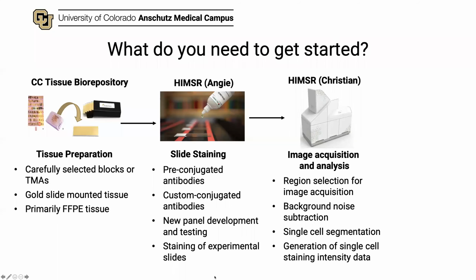Once the slides are stained and dried, they go to Christian in the HIMSR, who is our MIBI engineer and physicist. He has battled with both the beta instrument and our new commercial instrument to really make the workflow happen. He works on region selection for image acquisition.